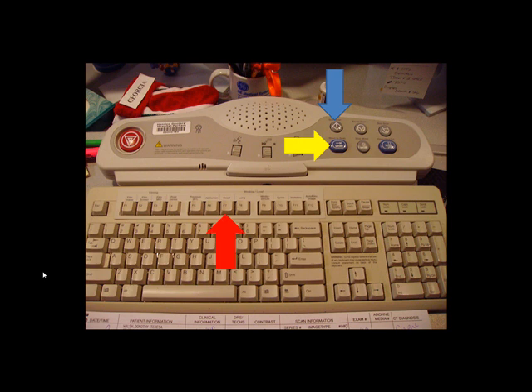Now you want the correct window level to pop up, so you're going to push on this button, which will bring up the head window level. Now once you've done your scouts, this is the screen that's going to pop up, and this is your protocol screen. We've talked about this before.